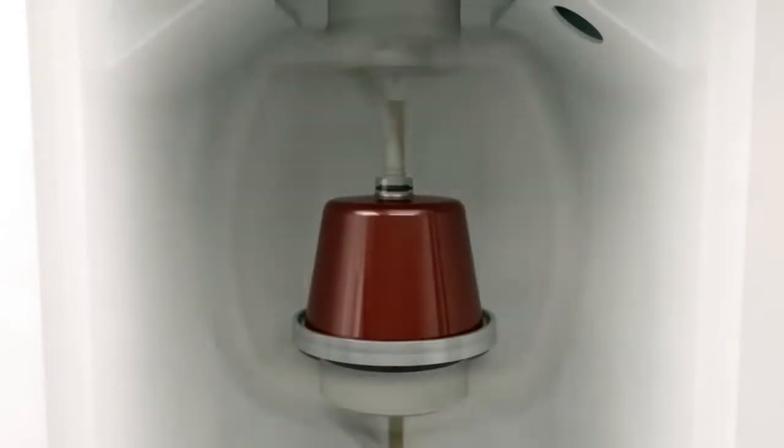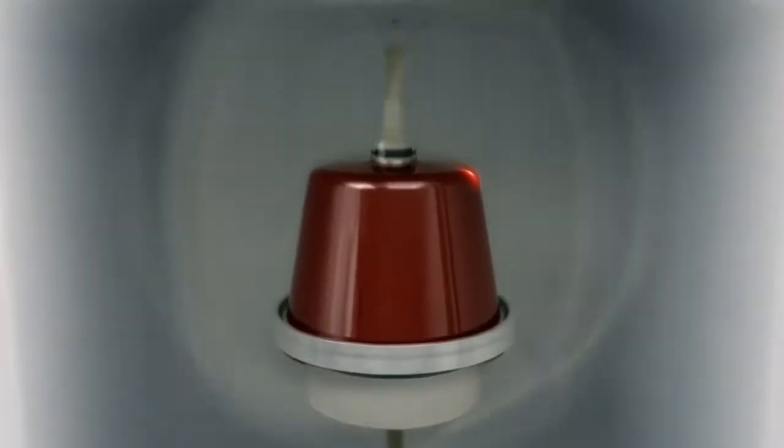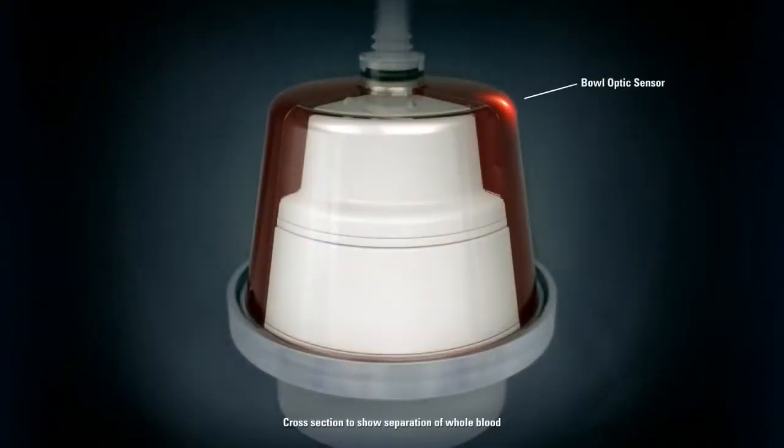The constant spinning of the centrifuge allows for clean separation of the different cell types. Bowl optic sensor technology detects the RBC plasma interface as it approaches the top of the bowl and continuously monitors the interface as the buffy coat fraction expands.